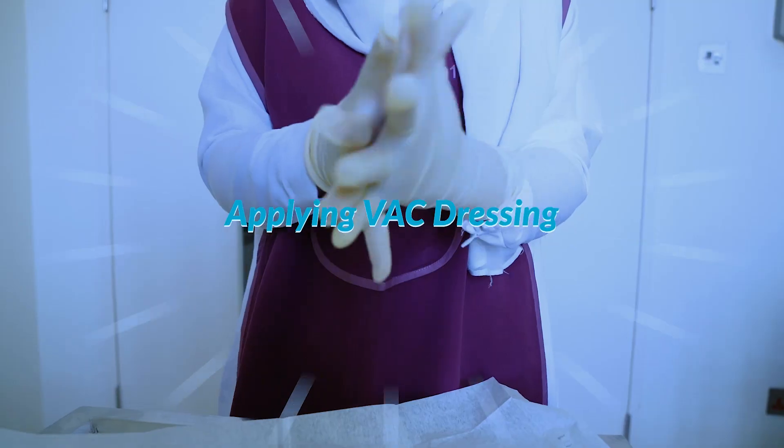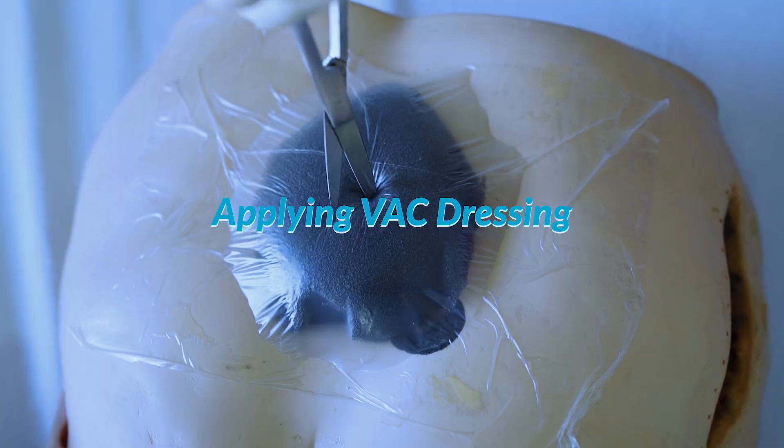Assalamu alaikum, I am Ayisha Lemke, staff nurse at surgical unit. Today I will demonstrate how to apply vacuum assisted closure dressing for a patient with a wound stage two and above.